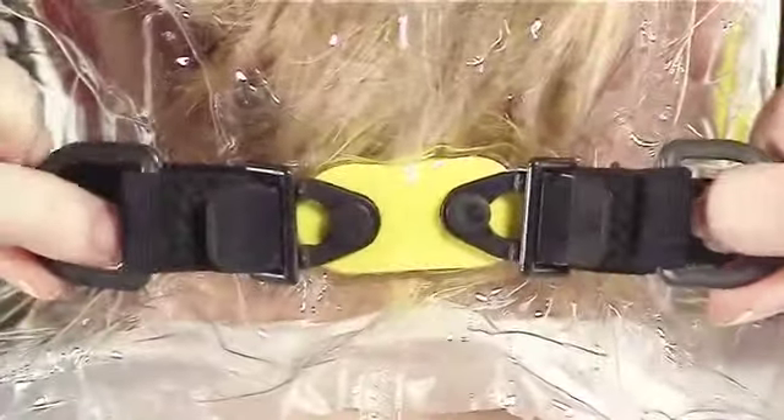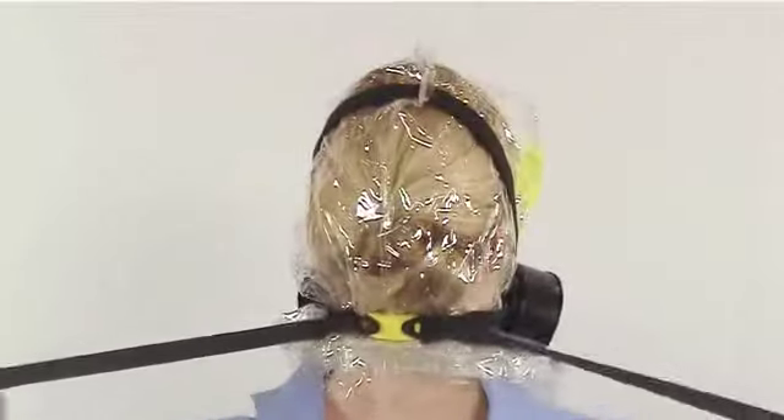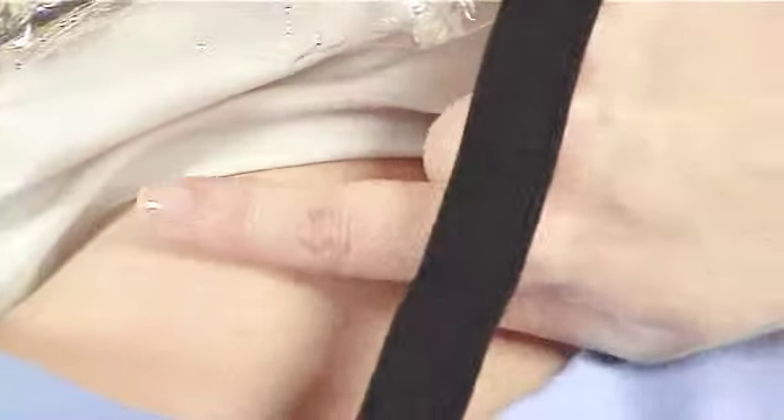Step 6: Quickly, with both hands, grab the ends of the straps and pull tightly so that the cup fits snugly. Step 7: Make sure the hood opening directly touches your neck all around.